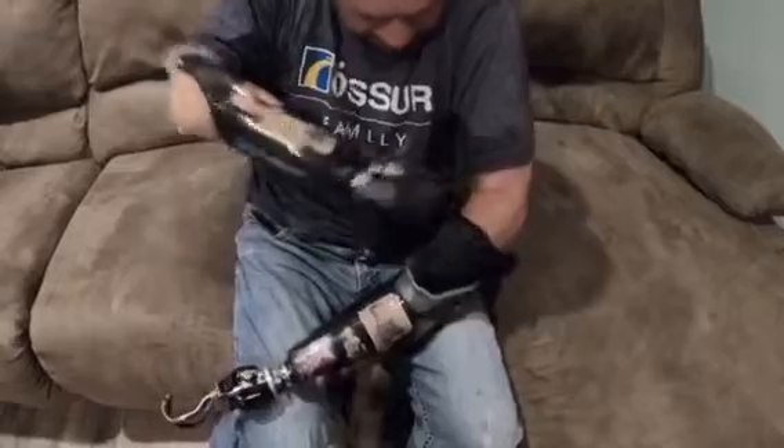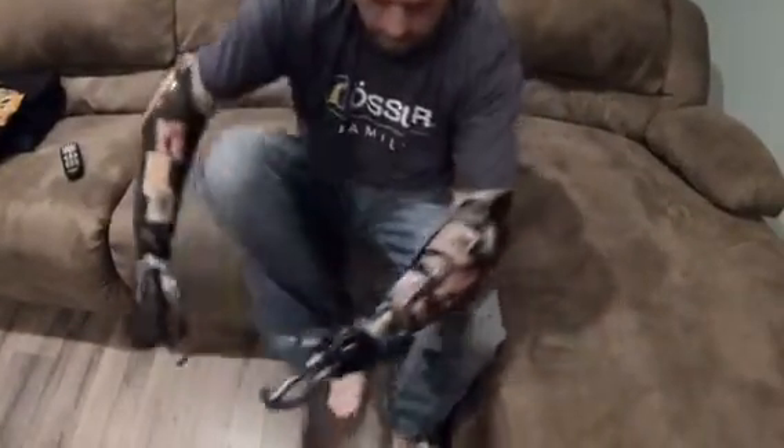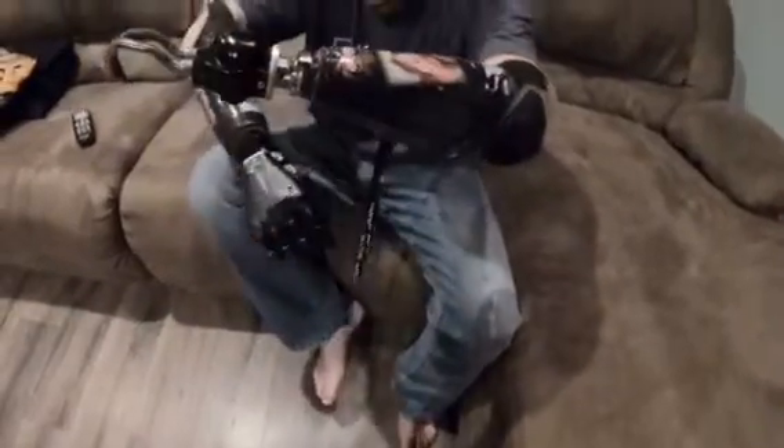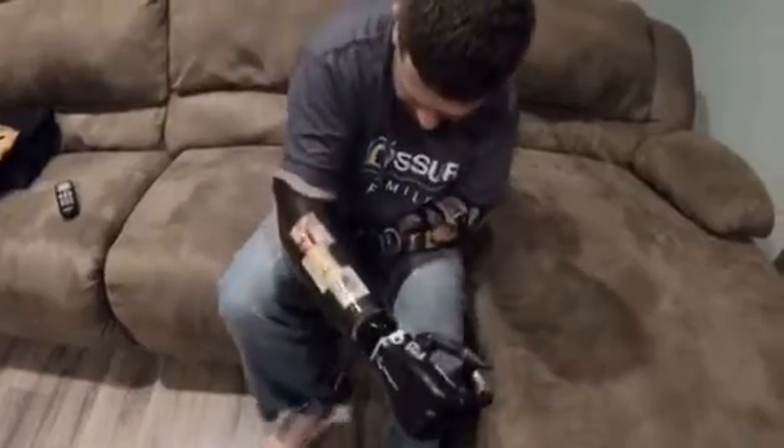So basically I stick my residual limb inside the bag, push in, put my foot in, pull the bag out. This one here actually has an on/off switch right there, so I turn it on.